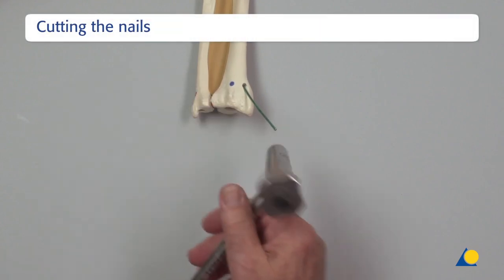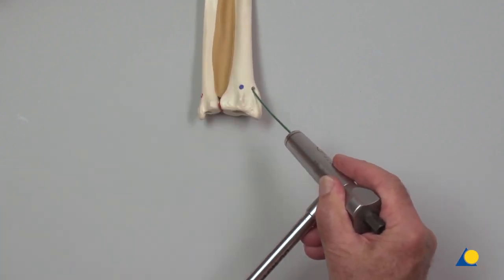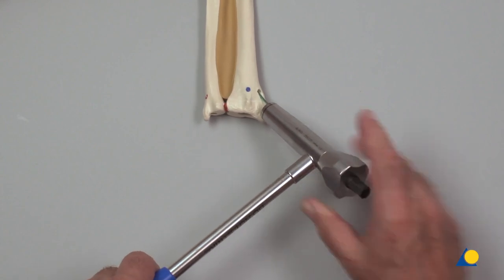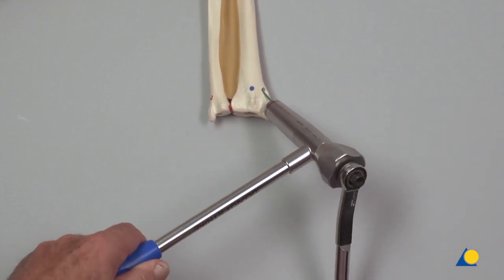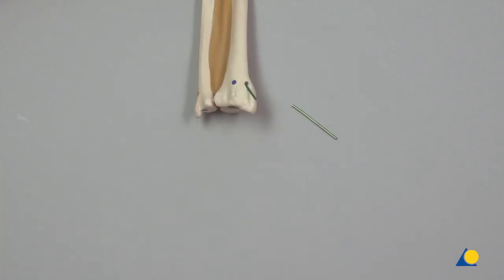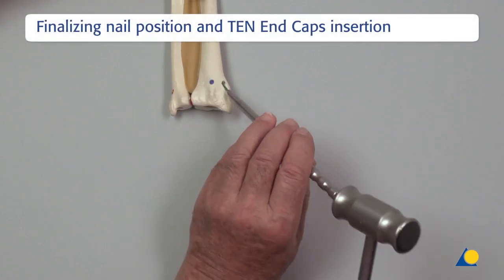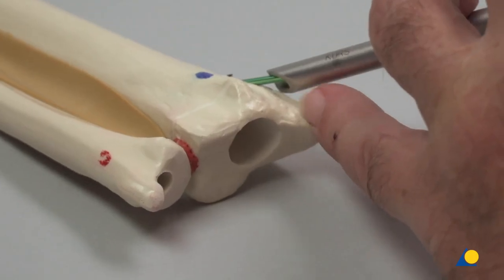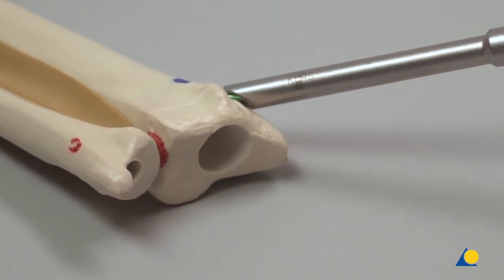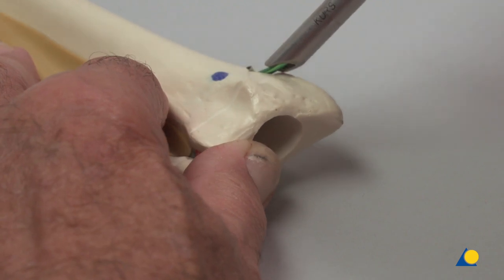Once the nails are correctly positioned in the opposite metaphysis, the protruding nail ends are cut approximately 1 cm from the bone. The bevelled impactor for TEN and the hammer are used to push the nails in both bones into their final position. At least 5 mm of the nail end must protrude beyond the cortex — it is crucial not to over-insert the nail. If the nails are over-inserted, the extraction pliers for TEN must be used to retract them.